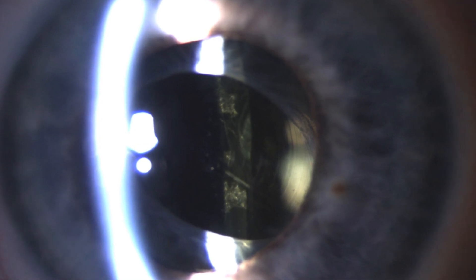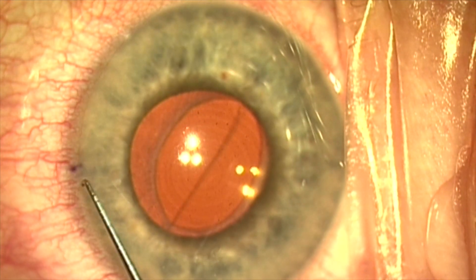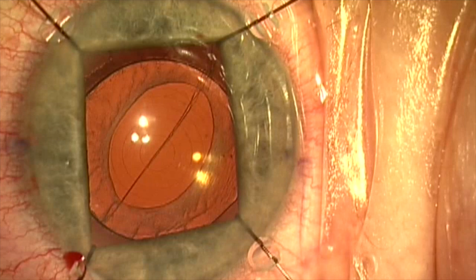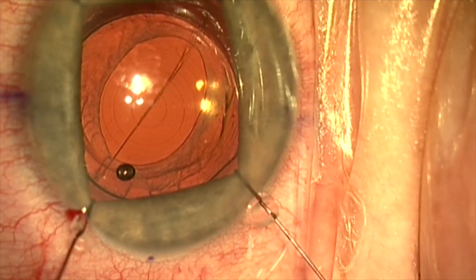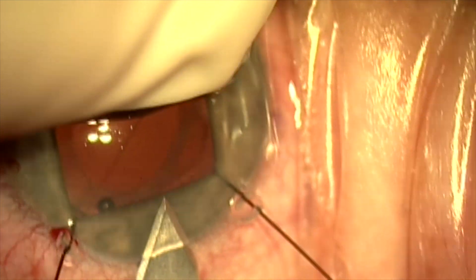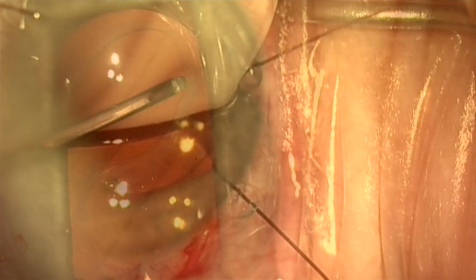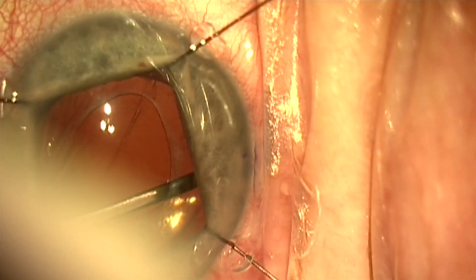This is a patient referred in from a distance who had cataract surgery the previous year with a PanOptix toric lens. She's never been happy with the quality of vision in this eye. It's a very small eye with a 21.5 millimeter axial length. The pupil dilates poorly. The lens is de-centered within the capsular bag about 1 to 2 millimeters, and there is significant capsular phimosis, making extraction of the lens difficult.